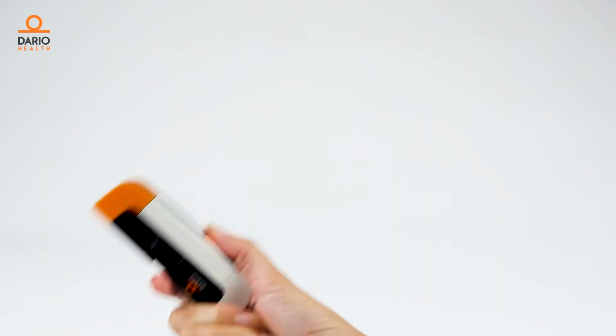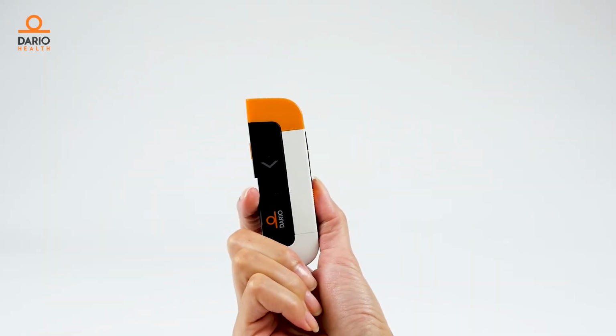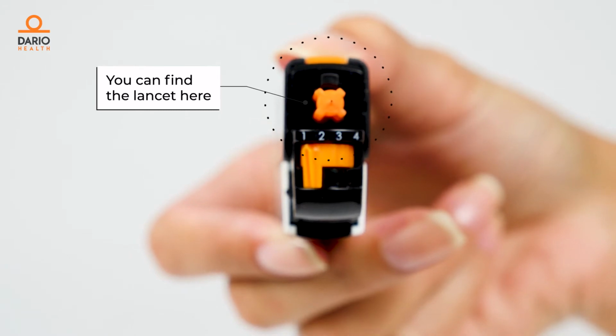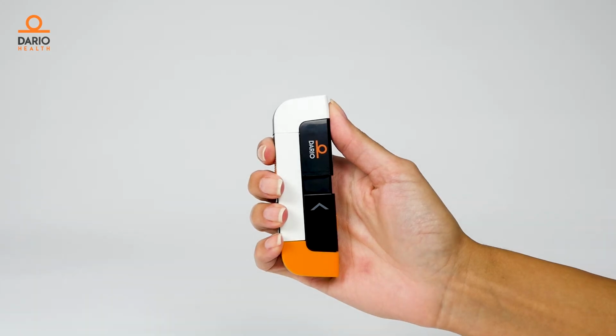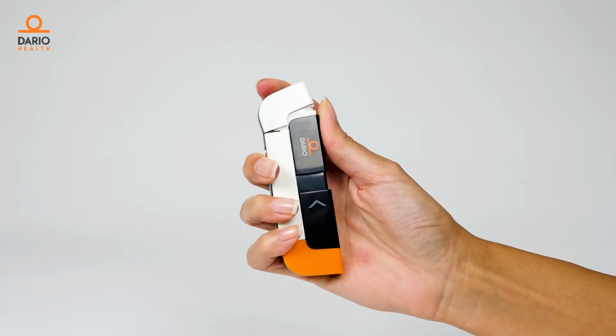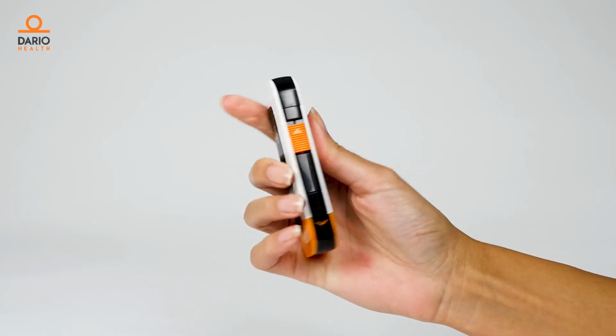It's easy to replace the lancet on your Dario. You can find the lancet here, on the end with the opening. To snap off the cover, hold it in your hands like this, and snap off the cover with your thumb. Notice you can snap off the cover from both sides.